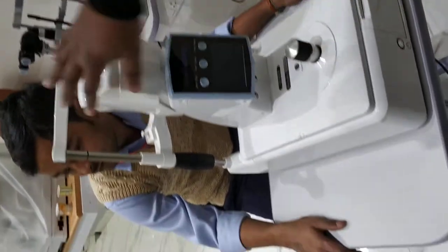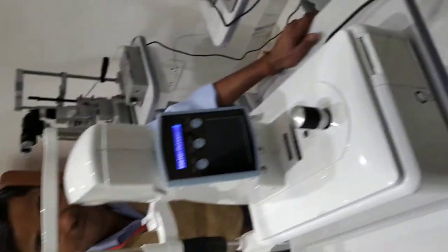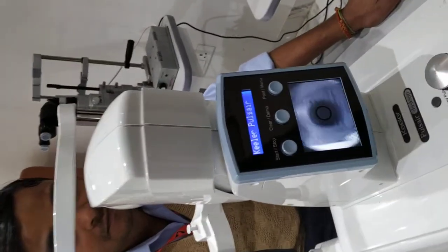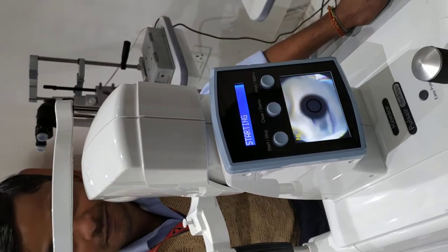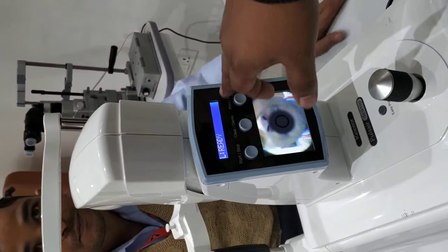This is the NCT. This is the On/Off button — we will start here. There are stages: starting, within seconds it will start, ready to use.